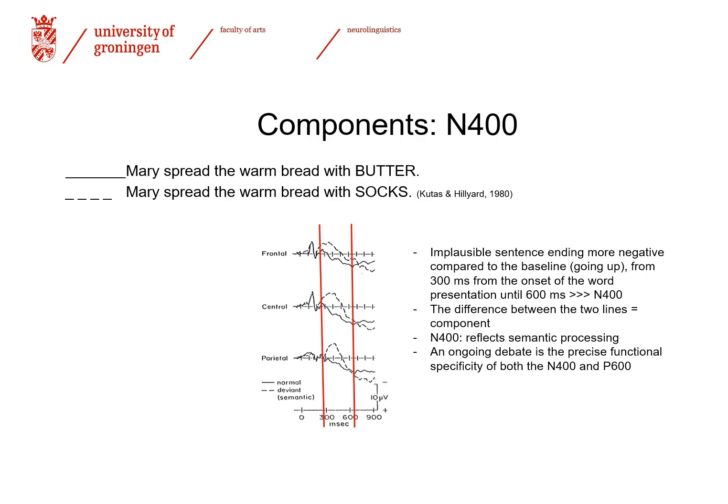experimental condition. If you look at the two, we'll see that they are identical or completely overlay each other up to some 300 milliseconds from the onset of the final word, which is the target or the region of interest. And then the two lines start to diverge, with the line representing the experimental condition being more negative.